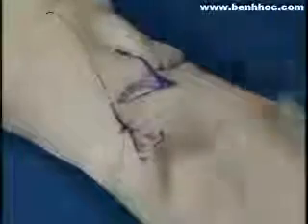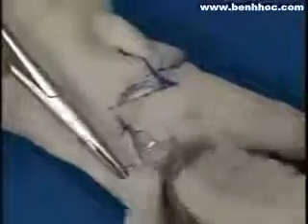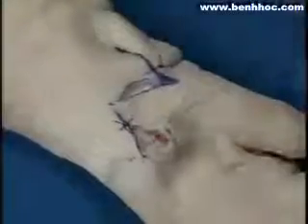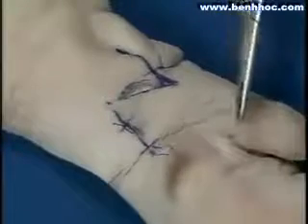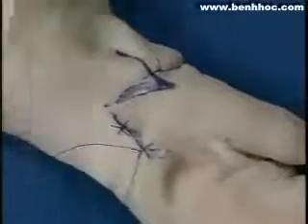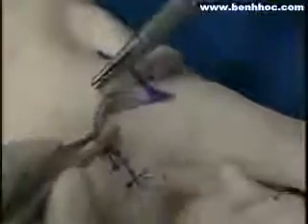Here we see the dog ear. So we place a suture to close this end of the flap. Placing it in position, we can see the dog ear has now been created. We will remove that by making the back cut and then sewing that into position. Here we're now closing the remainder of the flap.